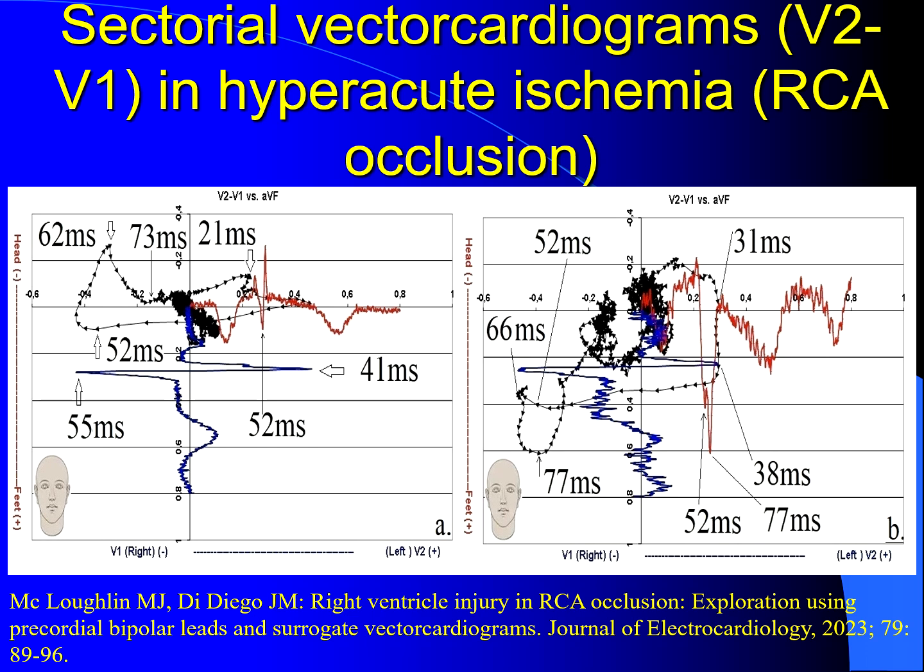This new method allows us to observe that since QRS prolongation is not observed, it is interesting to speculate that these alterations, as well as the subsequent ST change, could be due more to electrical potential differences than to intramyocardial ischemic conduction abnormalities.